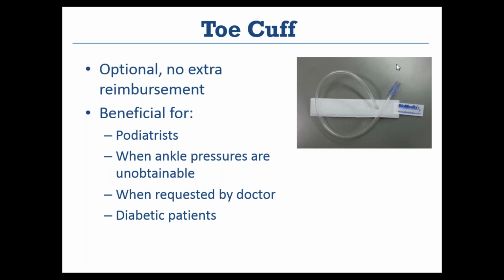If the patient has ulcers on their toes, or if they're a surgical candidate, but you need to check blood flow in and out of the patient's foot, or simply because the doctor requests it, those are all good reasons to get toe pressures or toe waveforms using the toe cuffs.